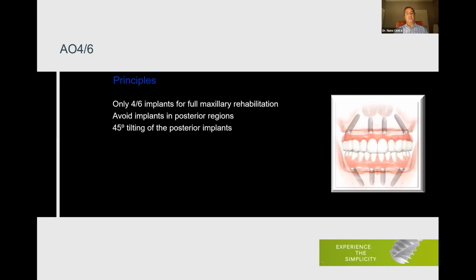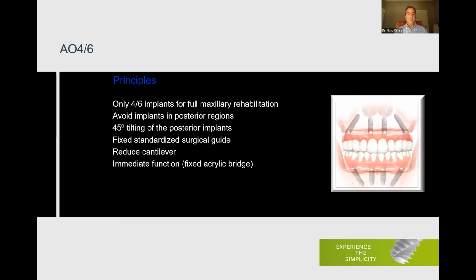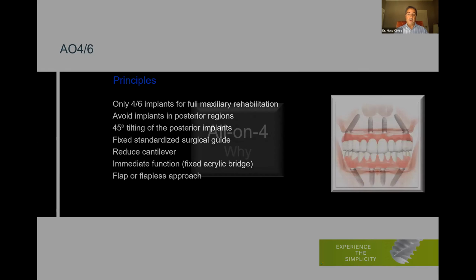With this technique, we tilt the posterior implants at a 45-degree angle. We use a fixed standard guide, which is malleable and made of titanium, and can be used in any arch. This way, by tilting the 45-degree posterior implants, we reduce the cantilever. We deliver on the same day a fixed provisional acrylic bridge with 10 or 12 teeth, depending on where the implants are coming out. And this technique can be done either with a flap or flapless approach.